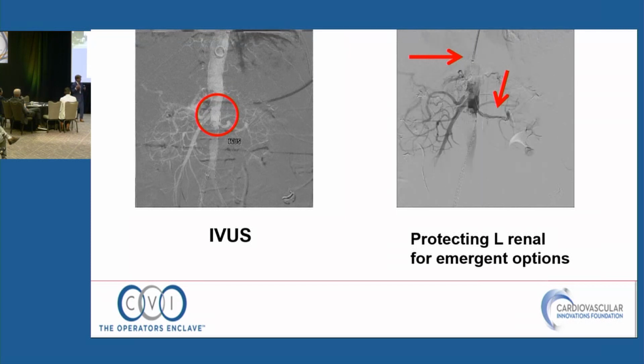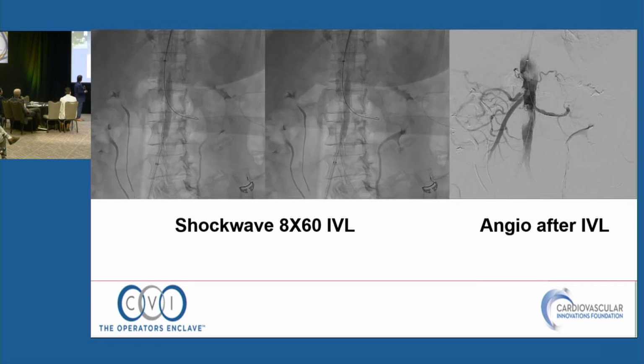If the worst happens, we were going to put a tube graft in there, and we would put a VisiPro in there and laser fenestrate like we would do for fenestrated grafts. So we had all that, the tube graft, everything measured, everything there, surgeons with me on this. So you got a Rosen wire from the left renal artery.